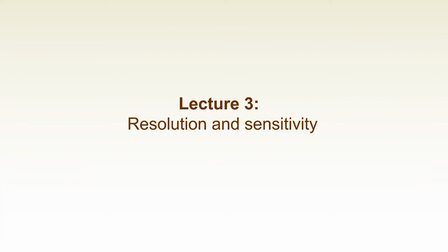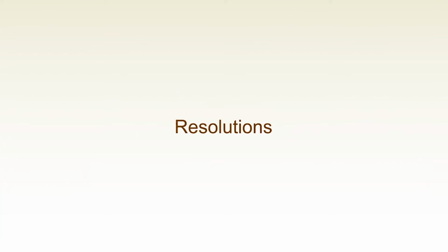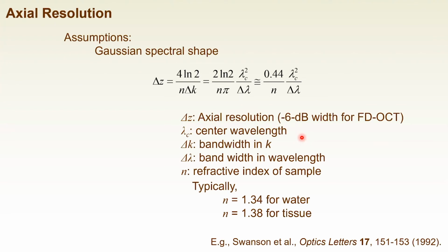Okay, so let's start the first section of today's lecture. It is about resolution. The resolution includes 2 points. One is the axial resolution, which we also call the depth resolution. And the second is the lateral resolution.